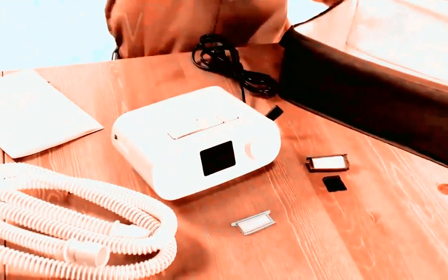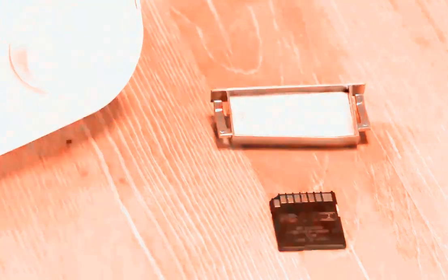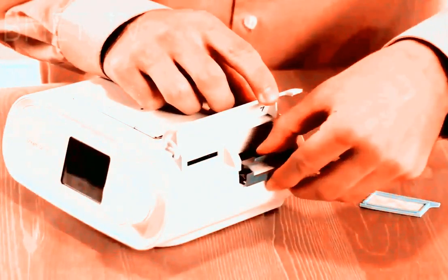A wide range of home care ventilators, HCVs, are now available for long-term mechanical ventilation. HCVs are heterogeneous with respect to technical performance and reliability, and their user-friendliness for the operator. However, this extended range of commercially available machines makes the choice of the best device for different categories of patients more difficult. Further, manufacturers often propose new ventilatory modes. But, as in the acute critical care setting, scientific evidence of their effectiveness and clinical benefit is often lacking. When choosing an HCV, clinicians rely on personal experience and, ideally, on the results of observational trials.